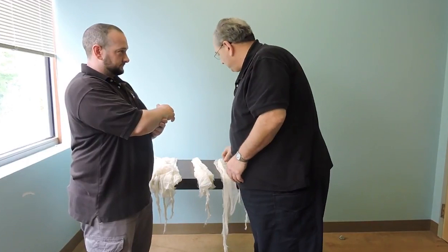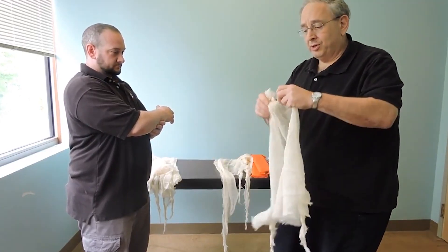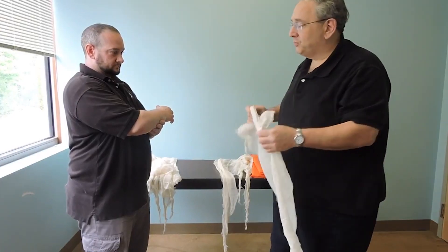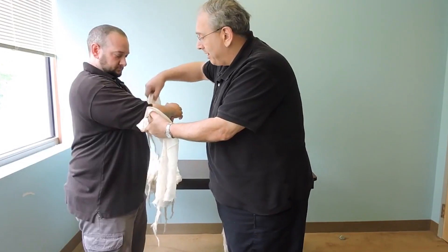My partner's still holding stabilization. I'm going to take that cravat that I put the knot in, and that knot goes right here at the elbow — that's going to hold the elbow and keep it from sliding down the arm.